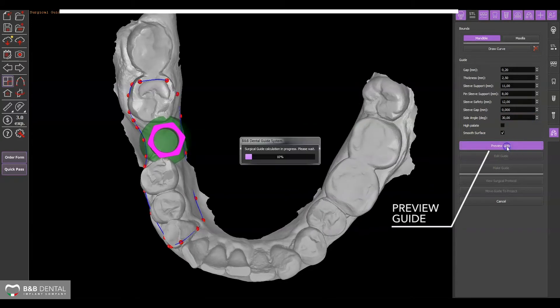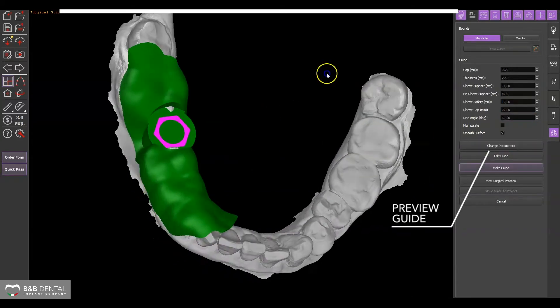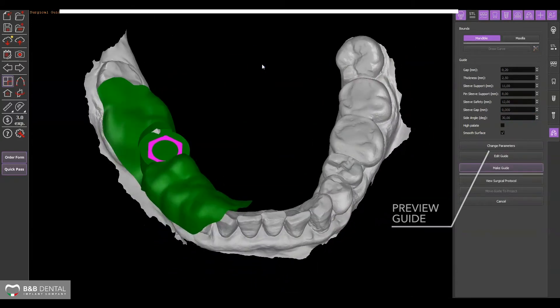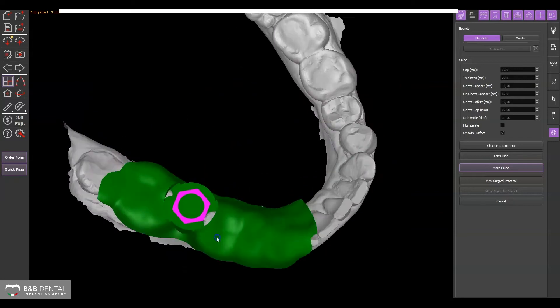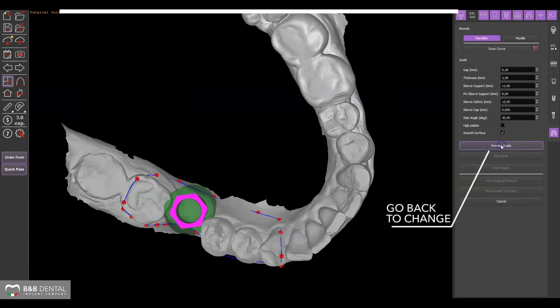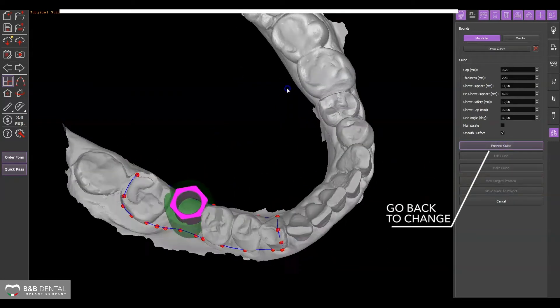If you wish to go back to improve the shape or change the parameters, click on change parameters and follow the procedures described above.